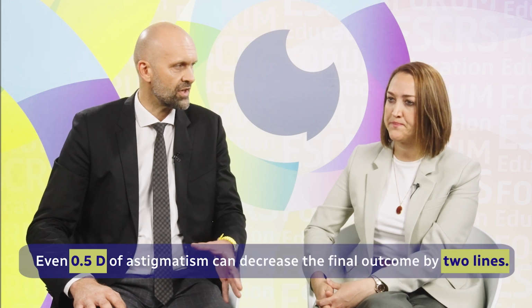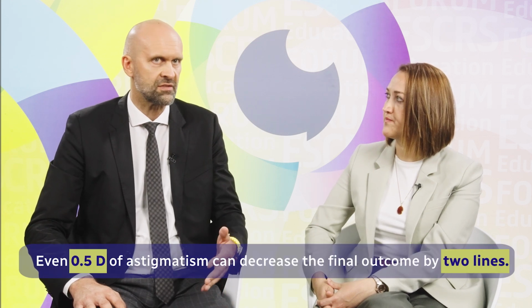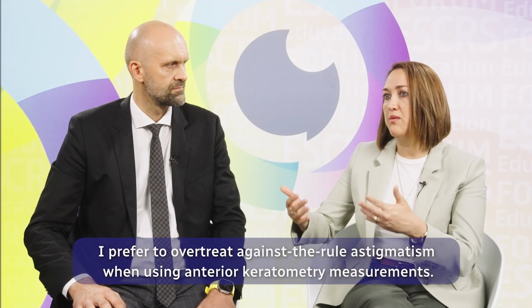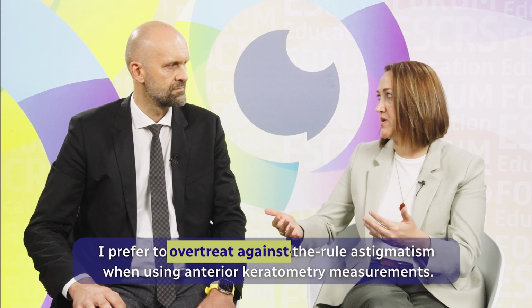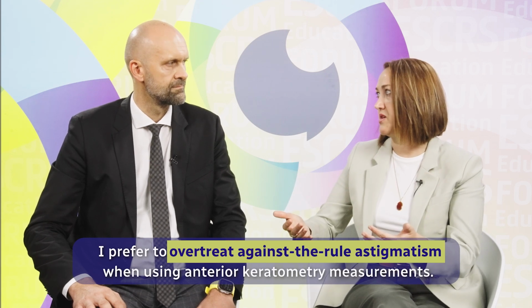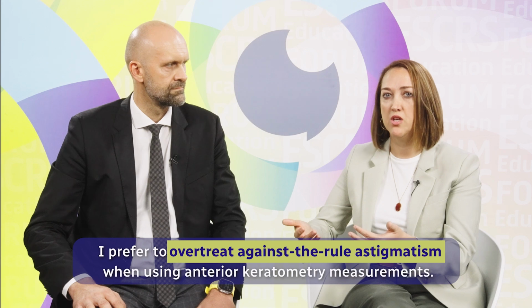And even 0.5 diopter of astigmatism can decrease the final outcome by 2 lines, which is a problem in multifocal patients. Yeah, absolutely. And I think we have to remember that the posterior cornea contributes additional against the rule refractive astigmatism, again at that 180, which is kind of the worst astigmatism to have. So, my rule of thumb is over-treat against the rule astigmatism if you're using anterior keratometry measurements alone.